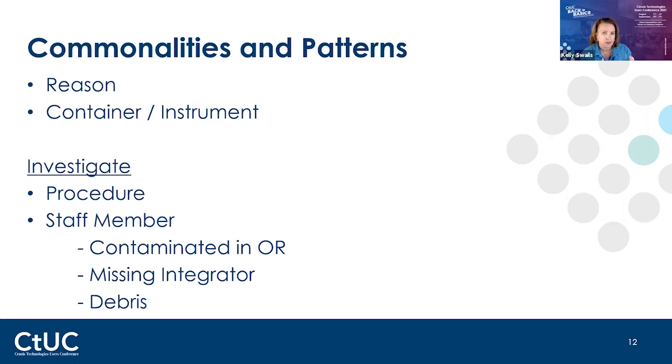So there's different tools you can use, but just basically using basic CensiTrac, the minute that loaner set is checked in and then scan and decontam, you can see then, yeah, you're right. We didn't have time to process it. It came out of decontam when we had to go IUSS it because of the loaner sets that arrived late. But I always do that root cause analysis. I always figure out, do that because that RCA will help you to identify what's happening, why is it happening, and then basically from there say, okay, how can we prevent it?